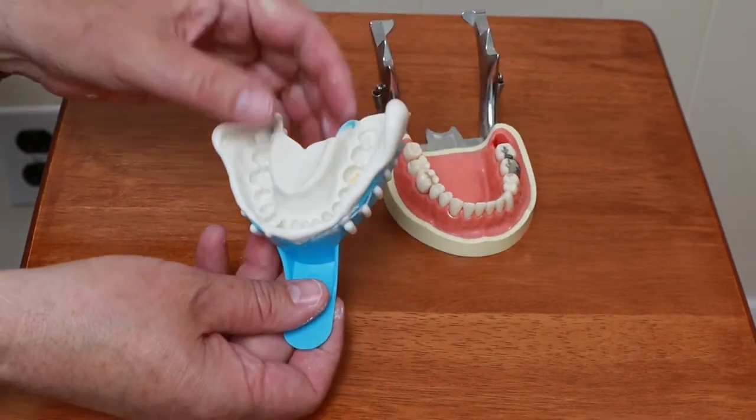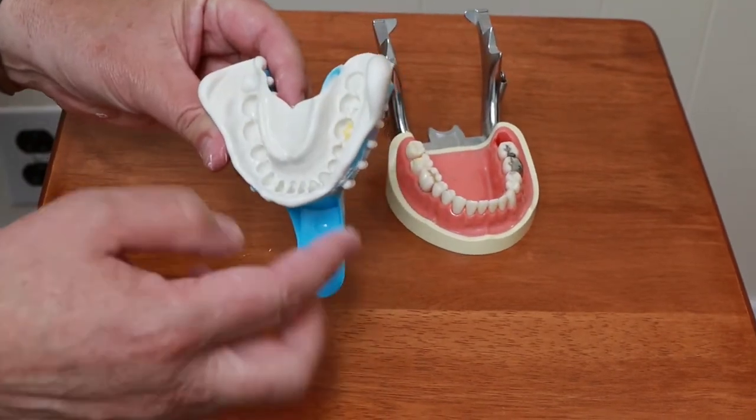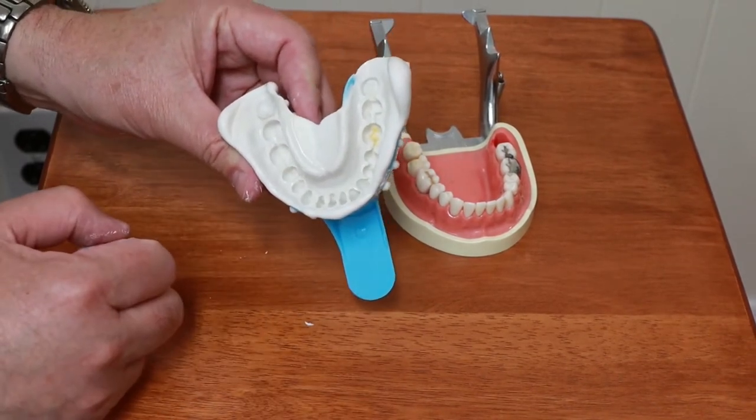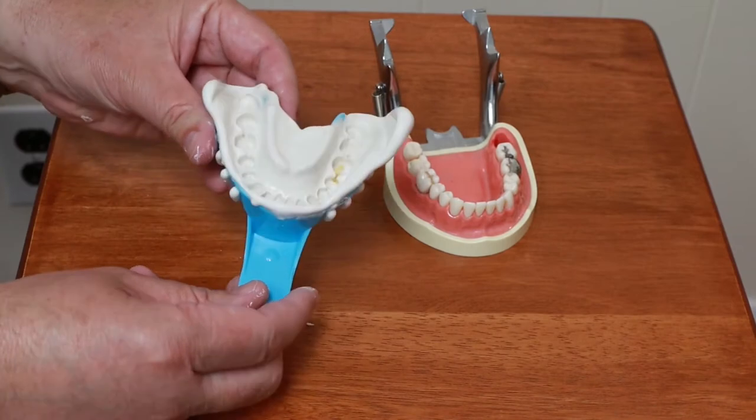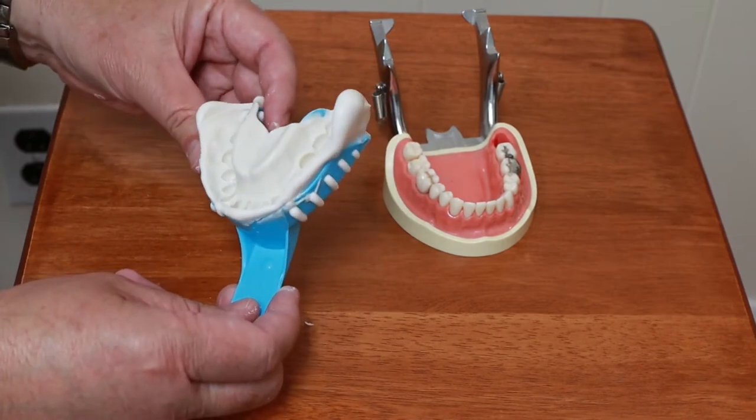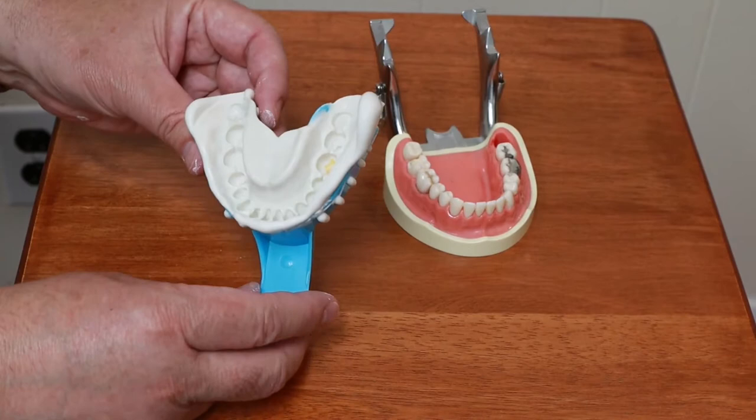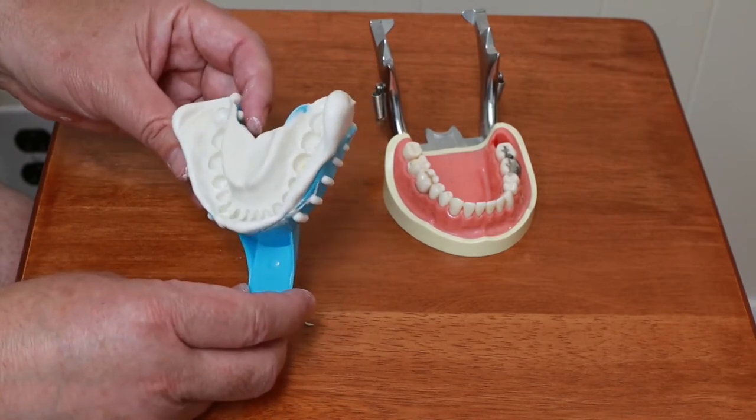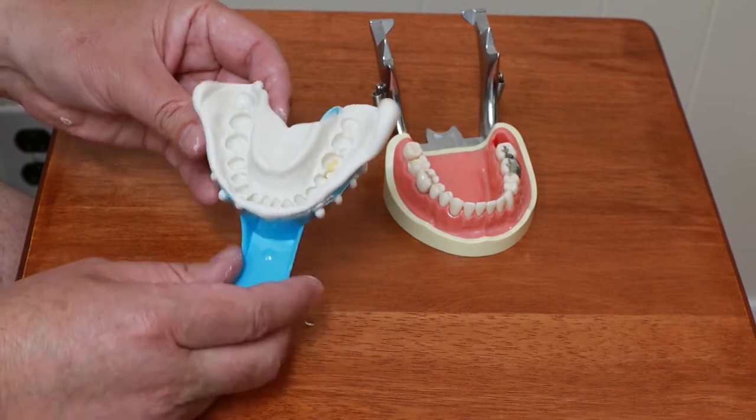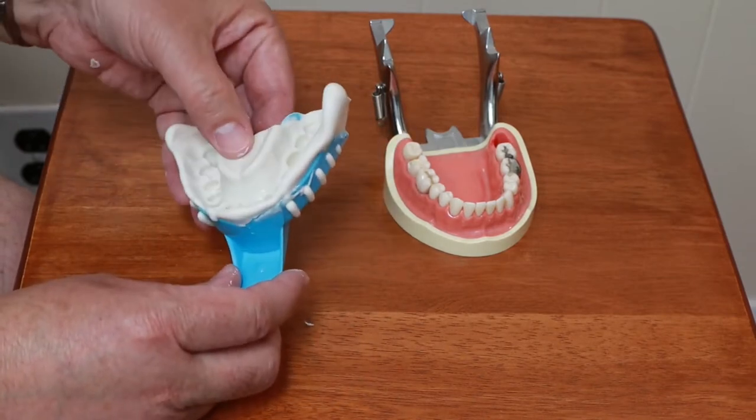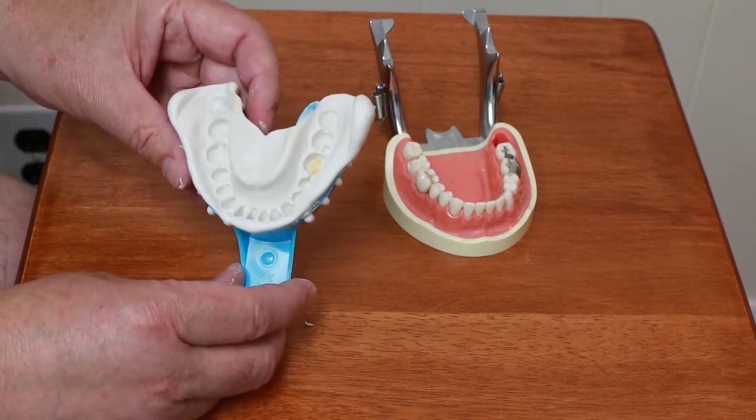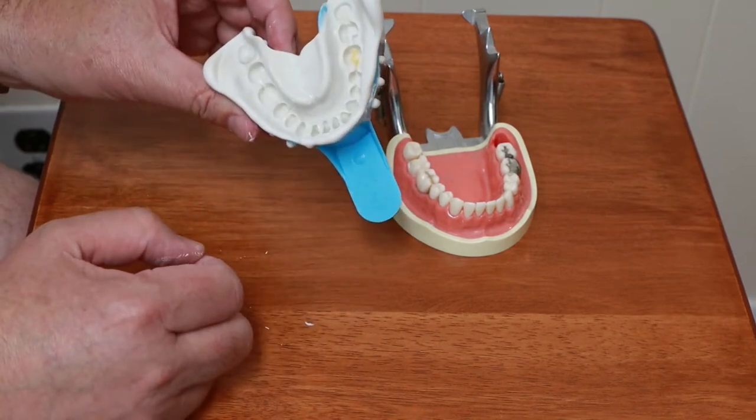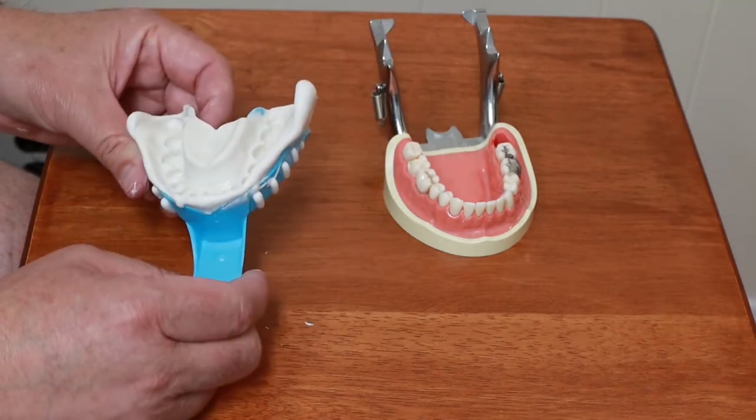For this mold I am going to pour this up in plaster before I send the impression out to the lab. The lab in this case is out in the Midwest so I got a FedEx it to him. This alginate material won't last the couple of days it takes for FedEx to get it to the lab. So I'm going to make a plaster model using this impression.